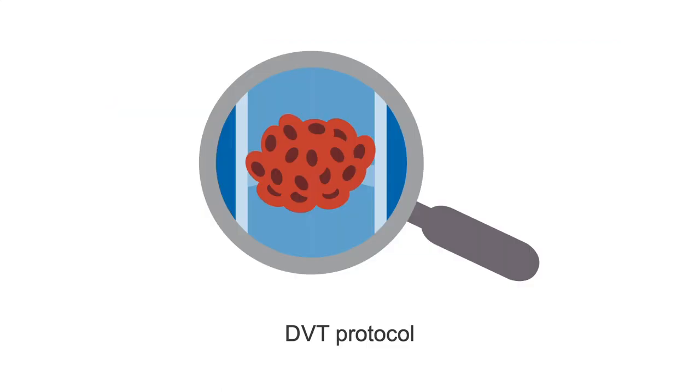Assessment begins with a deep vein thrombosis, or DVT, protocol to make sure that blood flow from the fistula has a clear path back to the heart. This is the same DVT protocol that we learned about earlier.